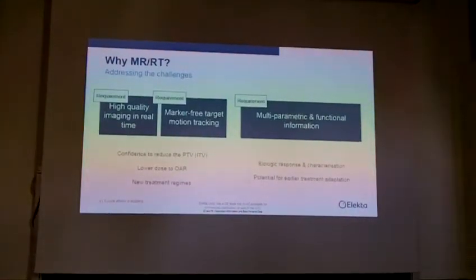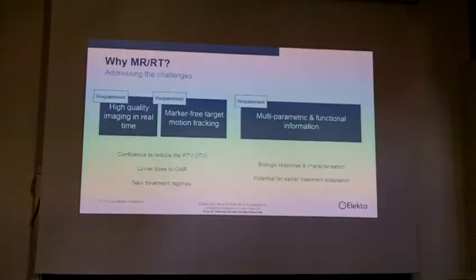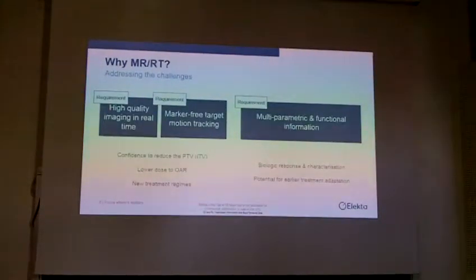An additional requirement would be to work with marker-free targets and track the motion without markers and without surrogates. This would increase the confidence to reduce the PTV to lower the dose to the organs at risk, and we could also push for new treatment regimes.